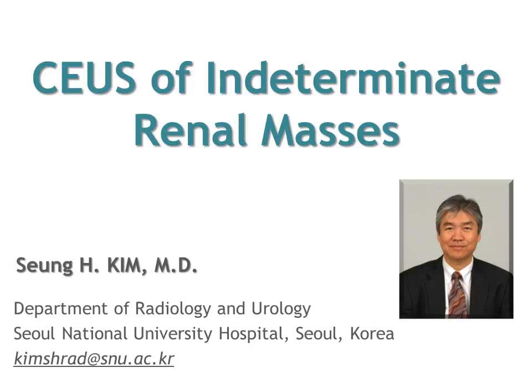Hello everyone, my name is Seung-Hyup Kim, Professor of Radiology and Urology at Seoul National University Hospital. In this session, I would like to share my experience of how we can use contrast-enhanced ultrasound in evaluation of indeterminate renal masses.